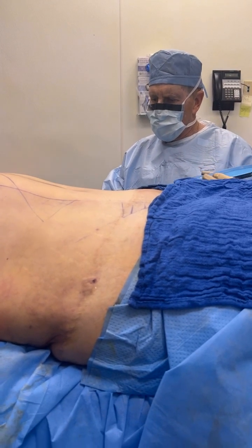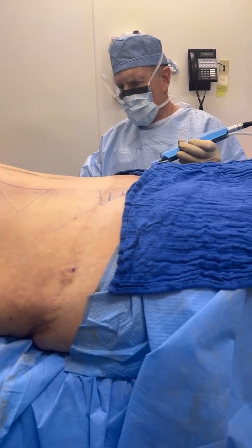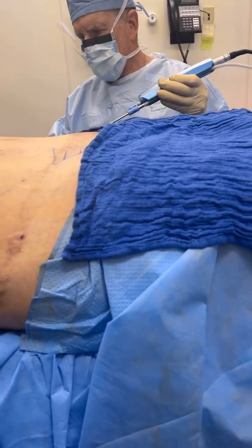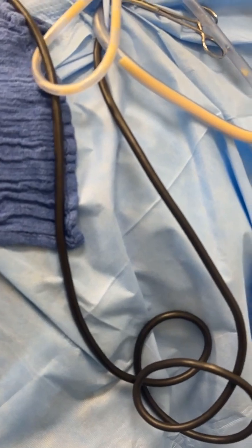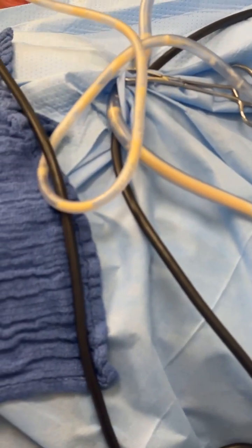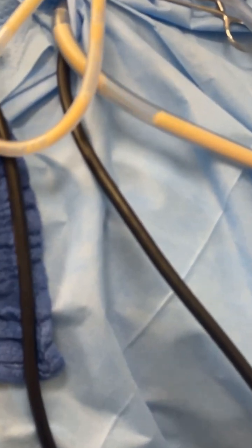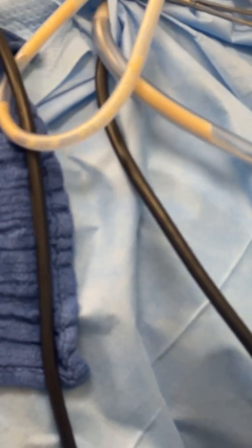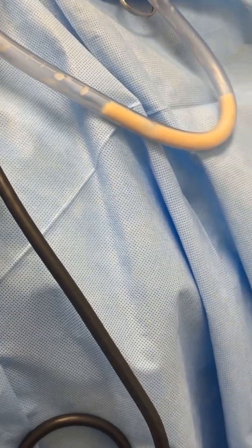Less risk of repetitive injuries like tendinitis, because you're using both hands, both arms, so less risk of tennis elbow, which is common with liposuction, tendinitis at the shoulder level, and even carpal tunnel syndrome. So for the surgeon, it's also advantageous to do this procedure.